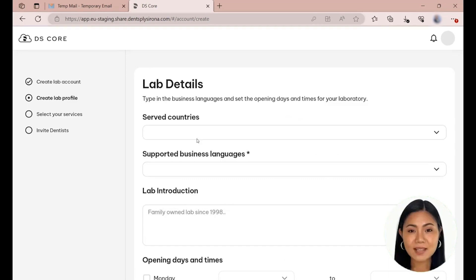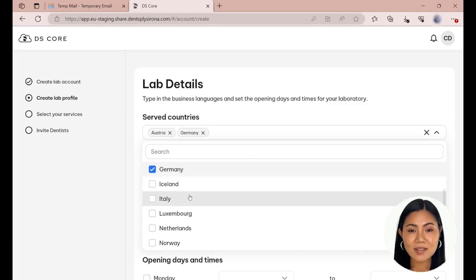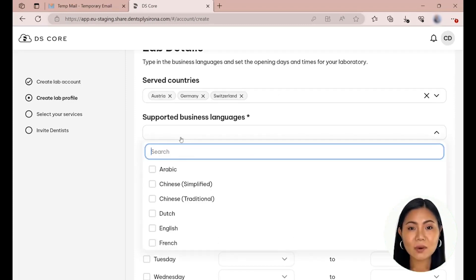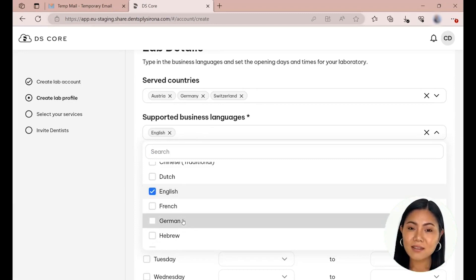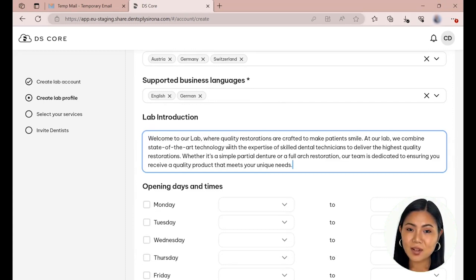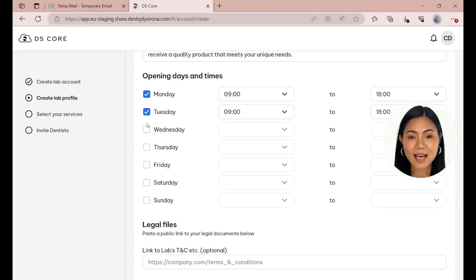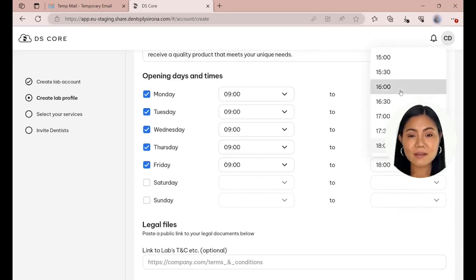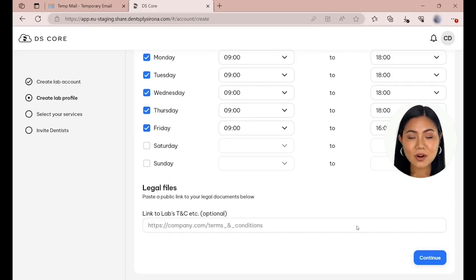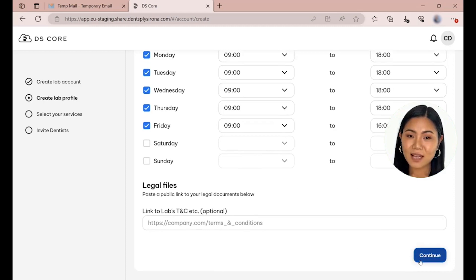The information provided on this page is displayed in the lab profile, which is accessible via a dentist DSCore account. Select all countries you want to serve with your services. Specify your supported business languages. In this open text field, you can write a short introduction about your laboratory. Specify your opening days and times for your laboratory. Here you can provide a link to your own terms and conditions. Note that your lab account will not be able to receive orders or to be found by a dentist on DSCore if this step is not completed. Now click on Continue.